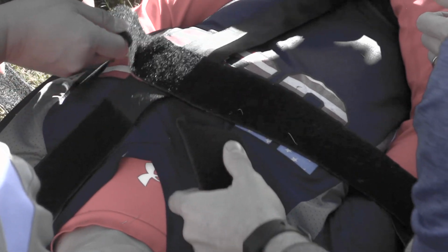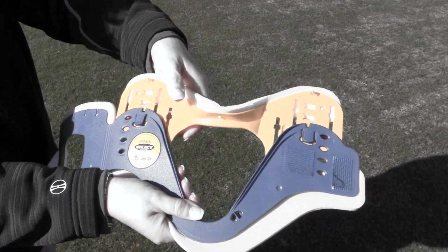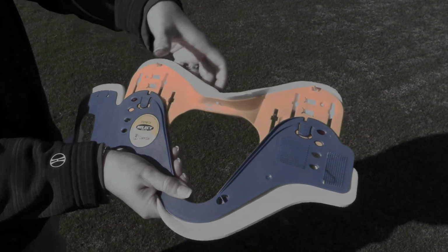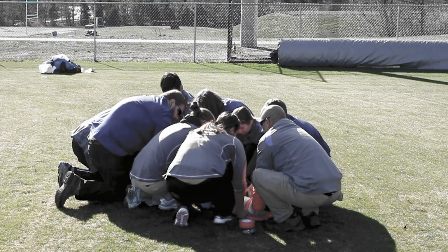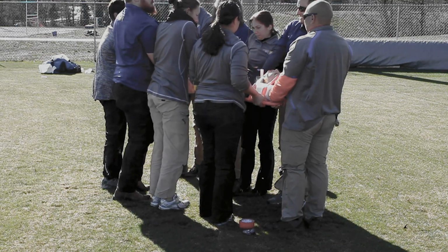An adjustable rigid collar is used to restrict spinal motion in the neck. These collars usually come in 4 adjustable heights, allowing the athlete to be kept in a neutral position without extremes of flexion or extension. Be sure to secure the position with the locks.